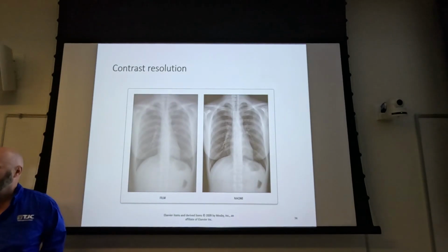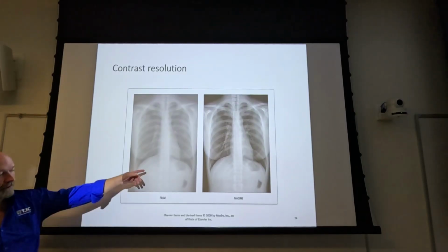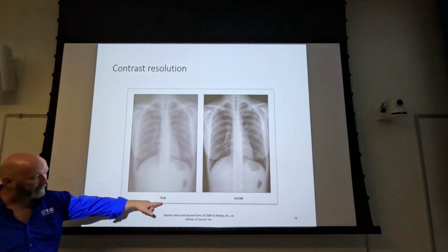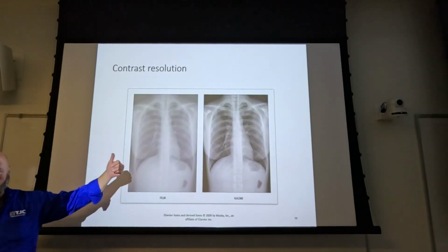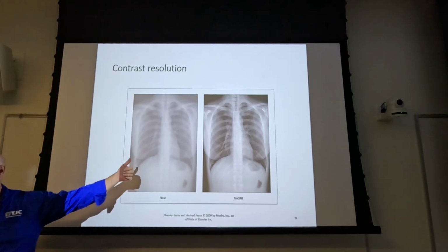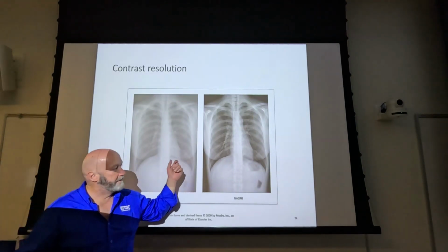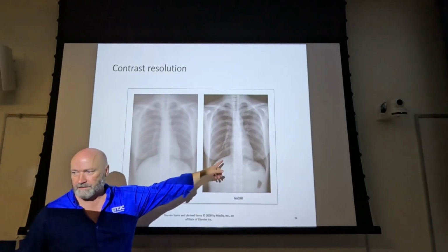tissue contrast. So we can sacrifice a little bit of radiographic contrast, and it's not really going to hurt it all that much. And in fact, we don't want our image to look like this. And even on film, if we had an image that looked like that, that was a repeat. You did something wrong to get that, or your processing chemistry was messed up. That's not normal, even for film. But it wasn't as high contrast as what you got over here.